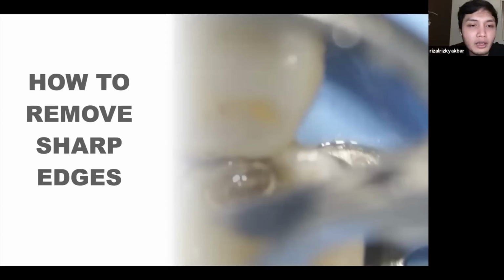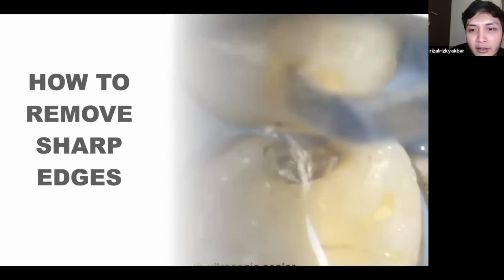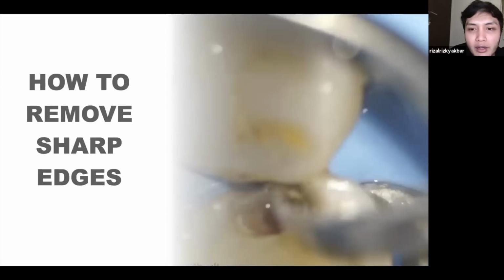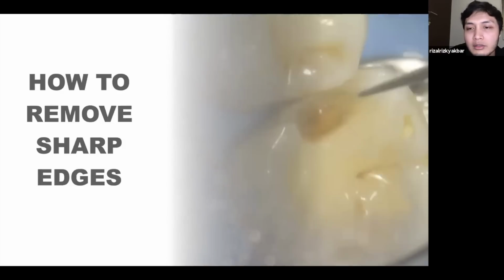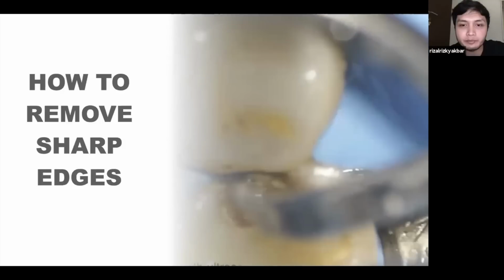How to remove sharp edges? Sometimes I use the ultrasonic scaler, just like in my video here. And after that, I make every edge rounded with the help of the superfine burrs, the needle one or the round one.